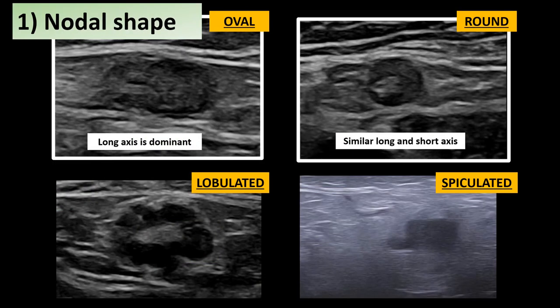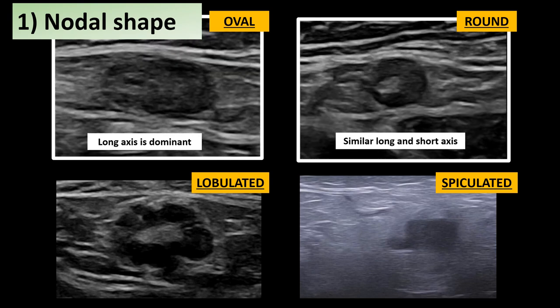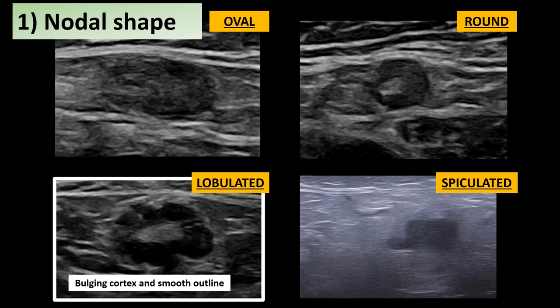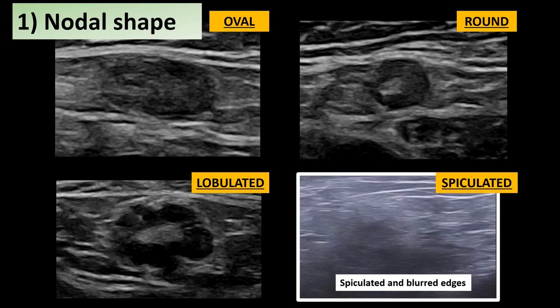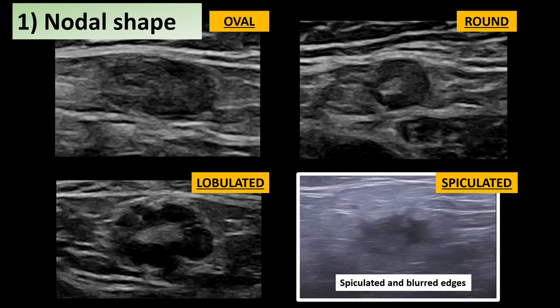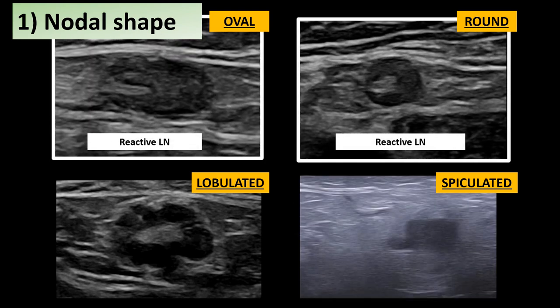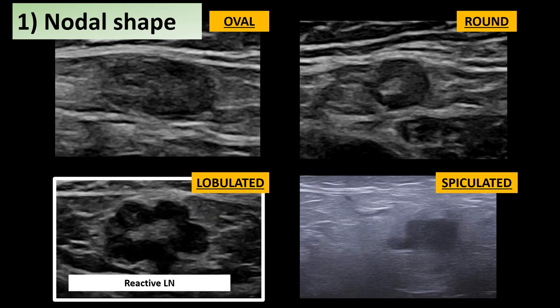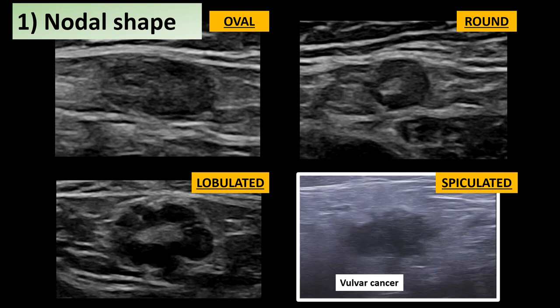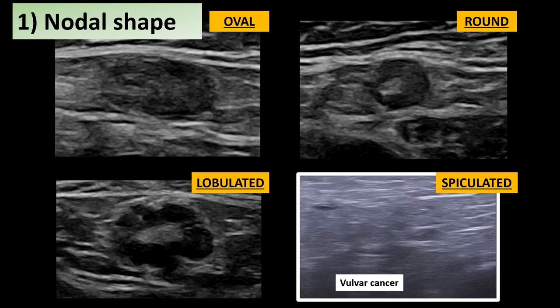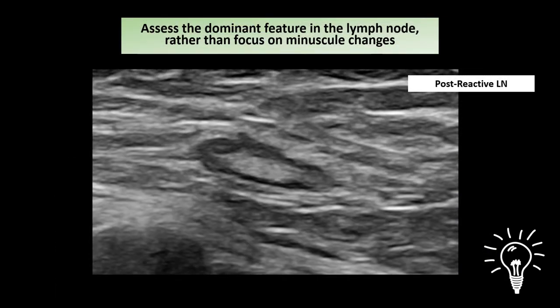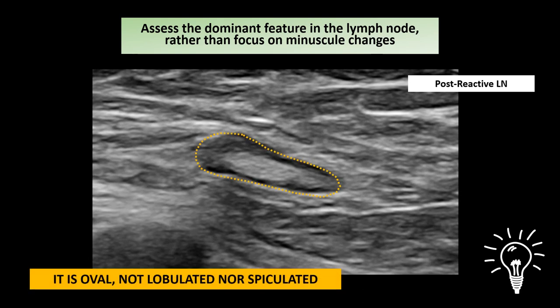In the first two videos, two regular lymph nodes are seen — one oval and one round. In the lobulated lymph node, the cortex has several bulges with smooth outlines. The last one is an irregular spiculated node with blurred edges. The two regular lymph nodes represent completely benign reactive processes. The lobulated lymph node is the result of reactive and post-reactive changes. The spiculated shape is typical of metastatic involvement, as seen in this completely infiltrated lymph node from vulvar cancer. When defining shape, consider the global appearance rather than irrelevant focal changes.